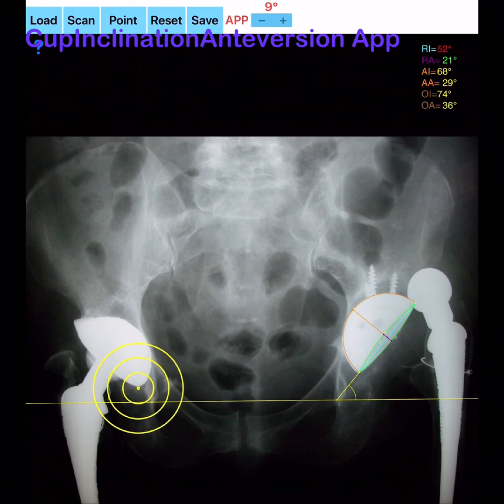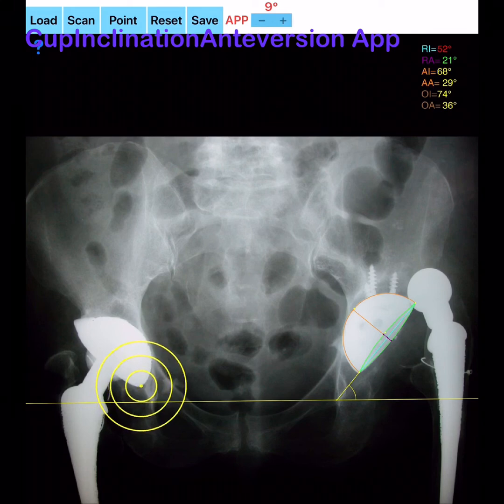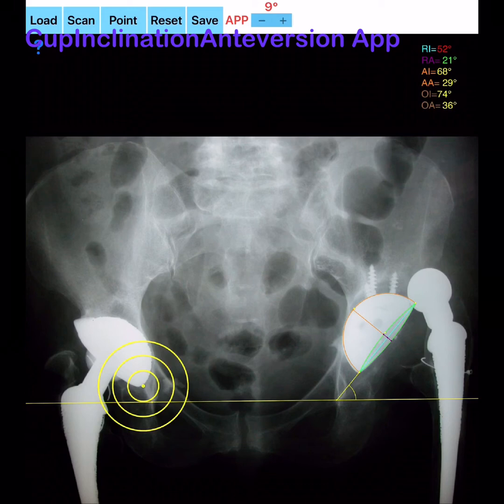The cup anteversion (AV) is calculated through the formula arcsin(short axis / total length), is calculated by the app and printed on the screen.